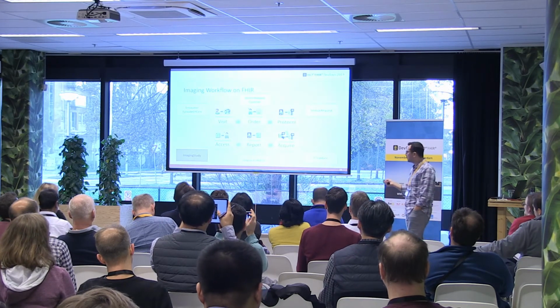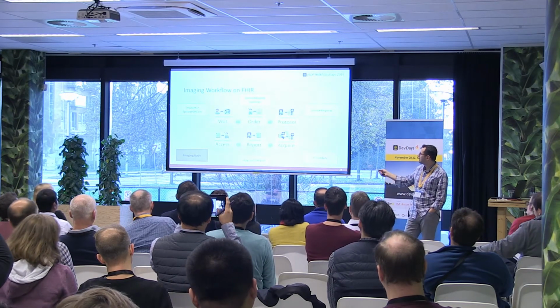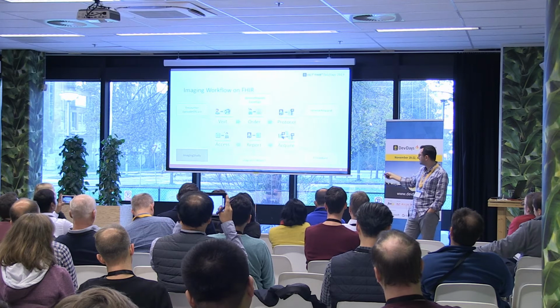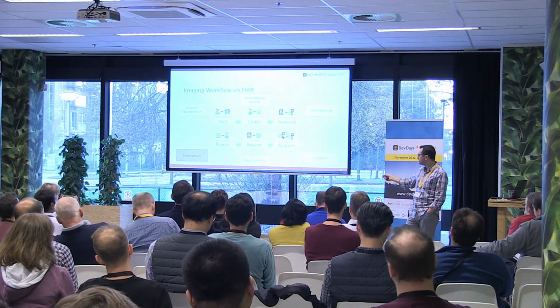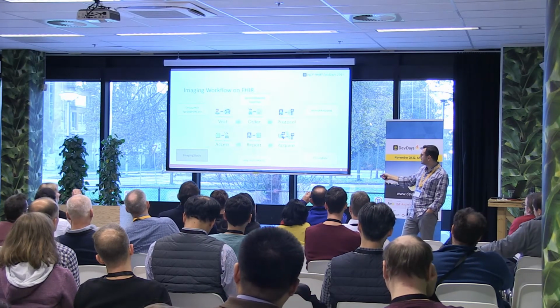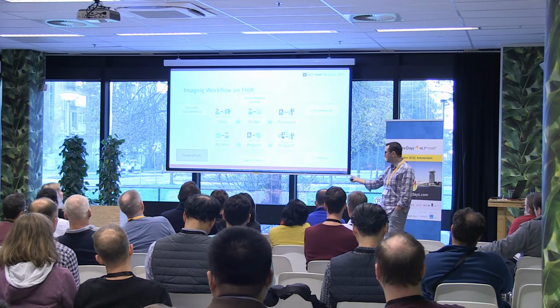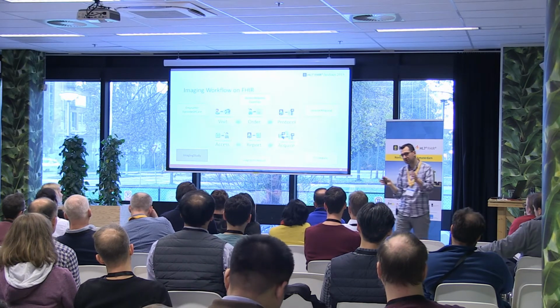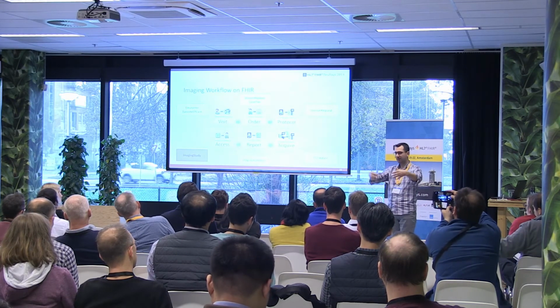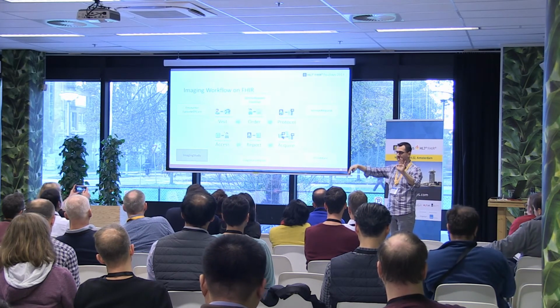Okay, so correlating these to FHIR resources, you have your encounter right here. Service plan, service request, and then the actual procedure that was performed. The diagnostic report is produced, and then the imaging study. Now, the reality is the imaging study was actually created here, but the point of accessing results and images usually comes after the report, because usually images initially are only restricted to people who are qualified to interpret these images, produce a report, and then everybody's given freedom to say, here's a report with the authoritative findings, and then here's some images for your reference.